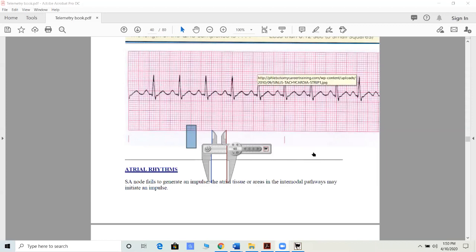Okay, yep. One answer is getting oxygen, yes. And the reason it's not going to be able to get as much oxygen is because it doesn't have time to rest. Notice, if you had to find the isoelectric line here, this is not even a rest, right? There's barely a rest here at 120. So if the heart rate were to continue at 120 nonstop for too long, this rhythm would start deteriorating, and the heart would, as Albert was saying, become starved of oxygen, in which case we would have an issue, okay?